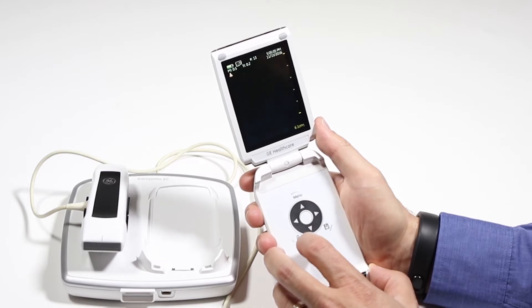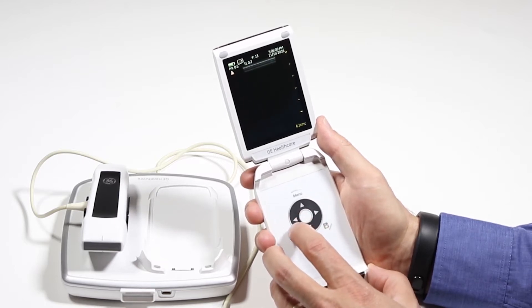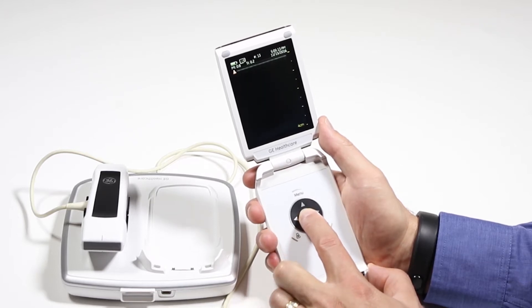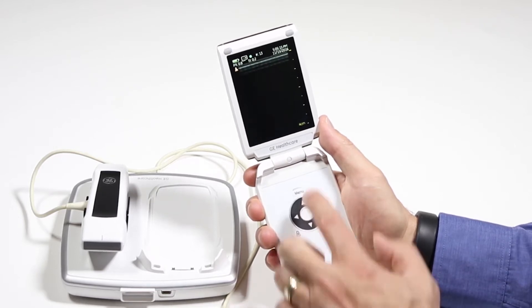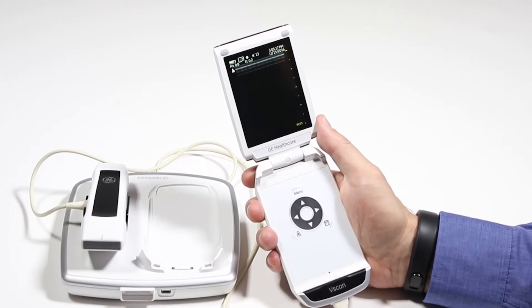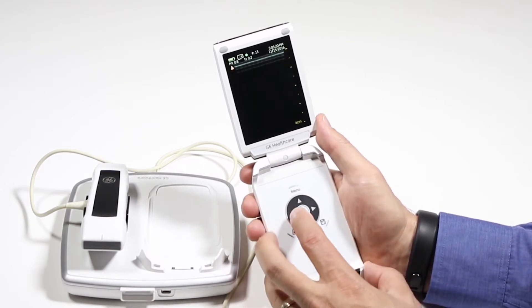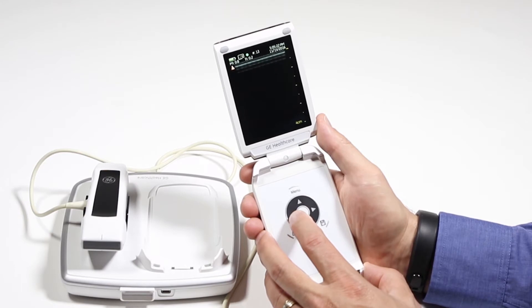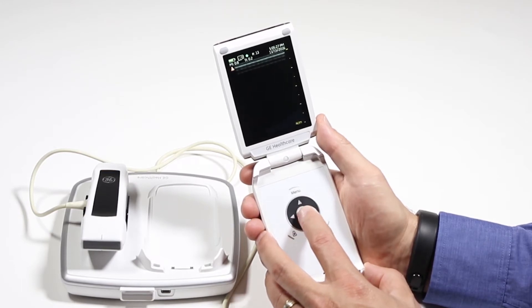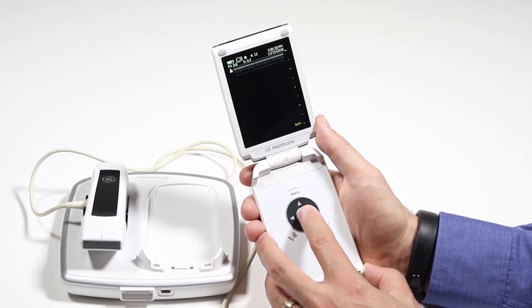A hidden feature that's pretty cool is the auto optimization feature. If I press and hold down here, I'll get a little green light right up top, meaning auto optimization is on. It will look at the image and try to get the best image based on what it's looking at, optimizing the contrast resolution.